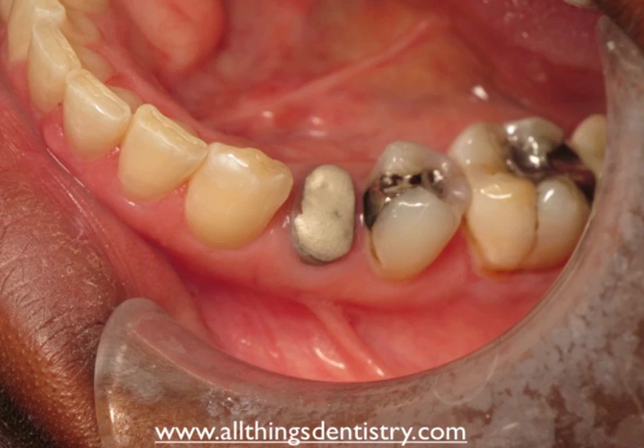This 39-year-old female patient presents to the perio clinic with a chief complaint of: 'I was referred here to get this tooth crown, whatever you guys call crown lengthening — some sort of gum surgery.' Tooth number 21, FDI 3-4, was endodontically retreated approximately six weeks ago, and an amalgam restoration was placed on the coronal surface.